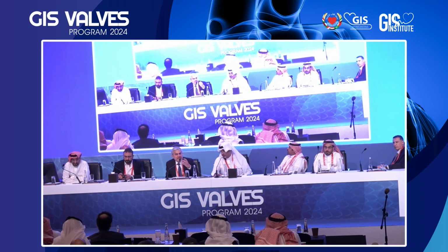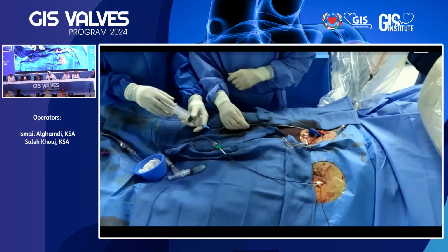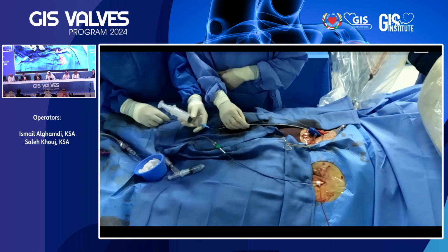Here, as far as the size, if we want to choose a self-expanding, again, I would respect the fact that at the commissural level it is narrower, so I'll go with that. So probably 29 would be the right thing to go. Dr. Firas Al-Ani? Yeah, I would definitely go with the 29 here and a self-expandable rather than a balloon.